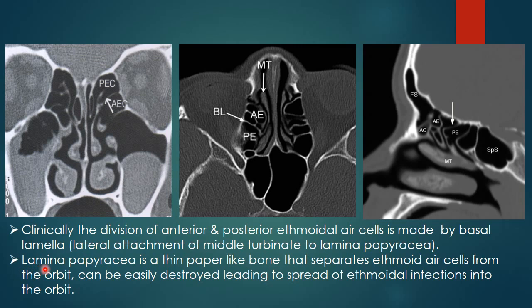Another important structure is the lamina papyracea, which is a thin paper-like bone. It is the only division between the orbit and the ethmoid air cells. Because it is very thin, it can easily be destroyed, leading to spread of ethmoid infection into the orbit — meaning ethmoid sinusitis can lead to orbital cellulitis.